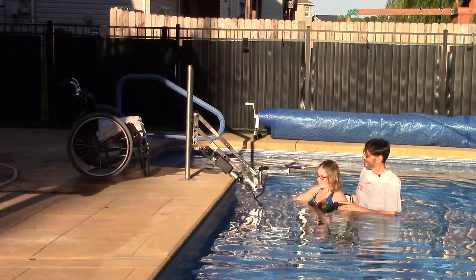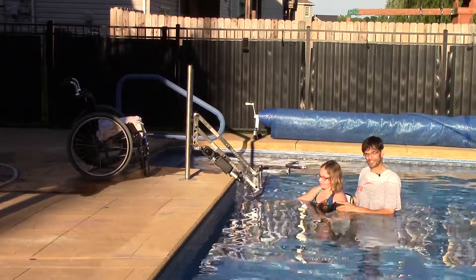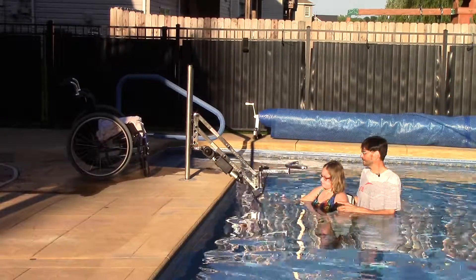This is a detailed video to show you how to use the multi-lift to exit a pool. It's designed to be seen in conjunction with other videos that are shown in the notes field below.